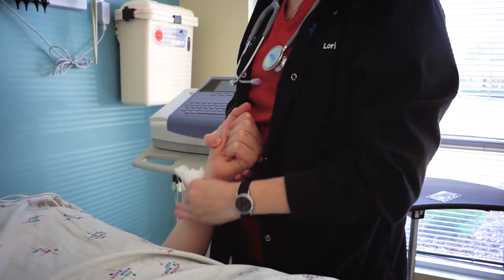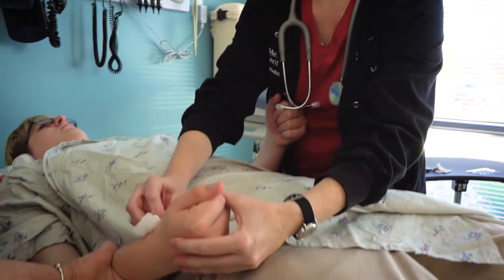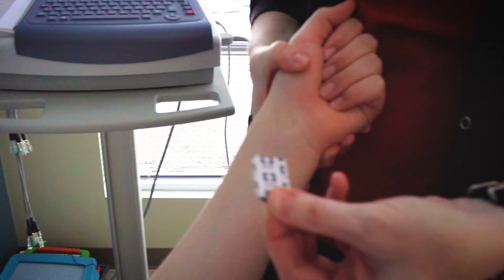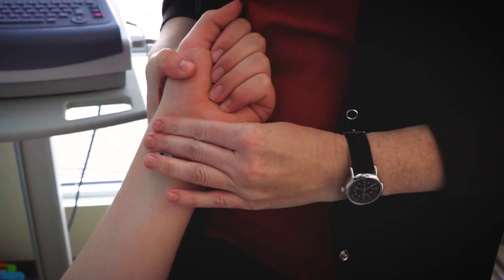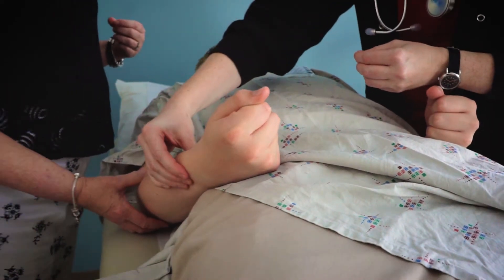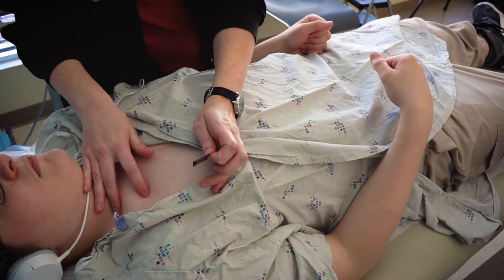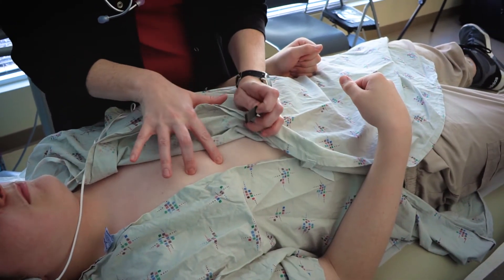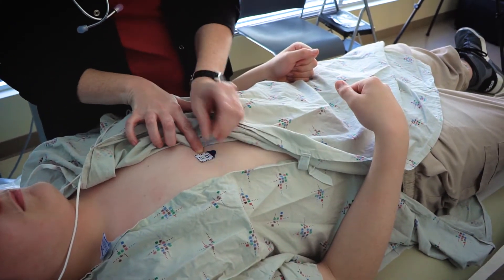For the procedural steps of an EKG, demonstrate each step in person or show the patient the companion CAST EKG video. It is recommended to allow the patient to see and experience the materials involved in the procedure. To build comfort with each step, bring extra stickers, gauze, and alcohol wipes for the appointment just in case.